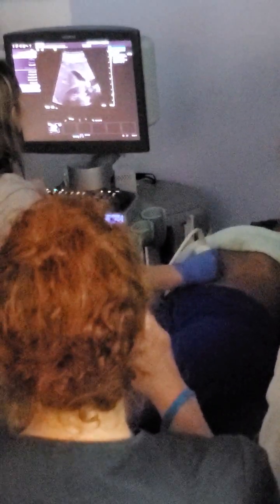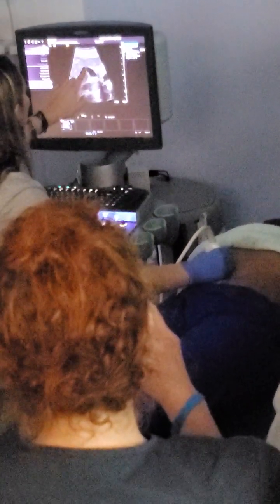Are you sure? I think oblique. So look at the wall symmetry. So I'm going to kind of change this. So see how furry this looks? Now, if I just kind of do clockwise, counterclockwise, things are going to look a little bit more... Using as much liver window as I can. Now we've got a little bit more symmetry on our walls.